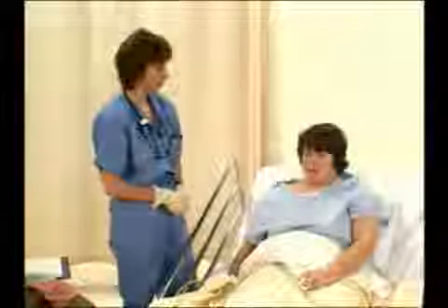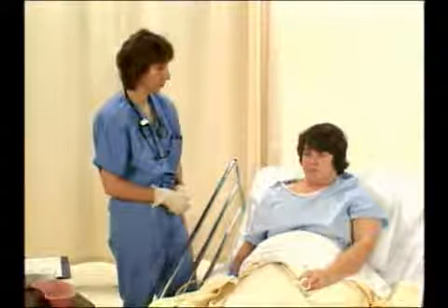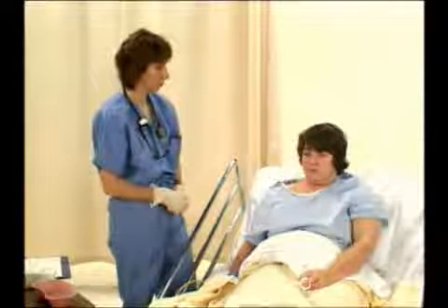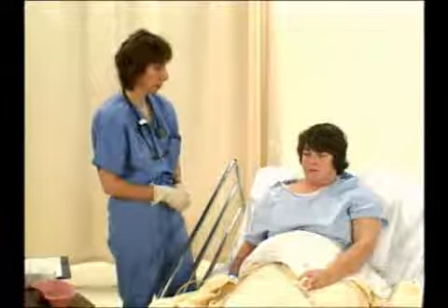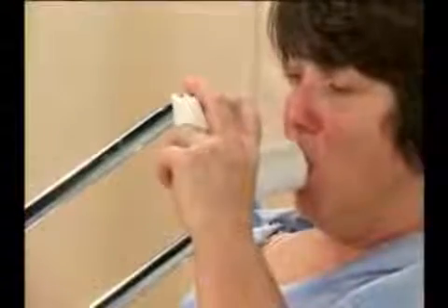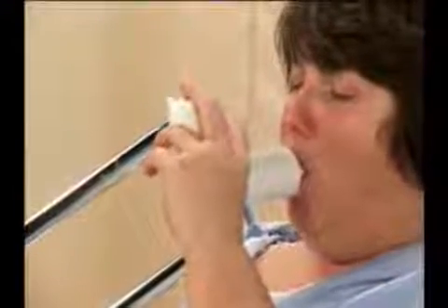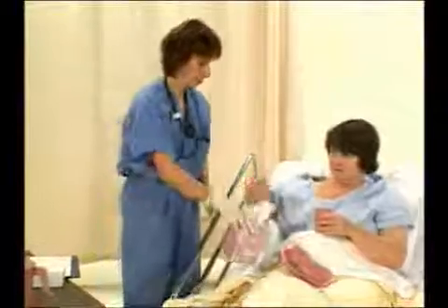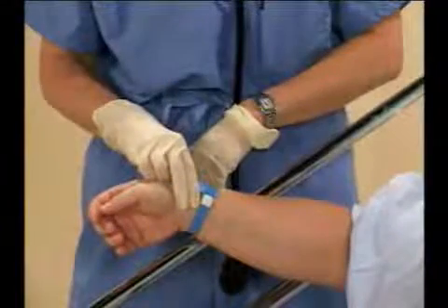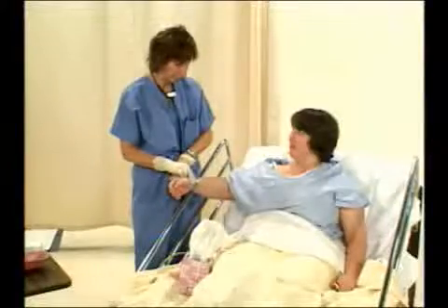Have the client try to hold the breath for 10 seconds if able, then remove the inhaler to slowly exhale. If the client is supposed to take more than one puff of the inhaler, have the client wait at least 60 seconds between each prescribed puff of medication. After the treatment, offer the client a mouth rinse with warm water or saline. Observe the client for several minutes to assess for any possible adverse effects from the medication.